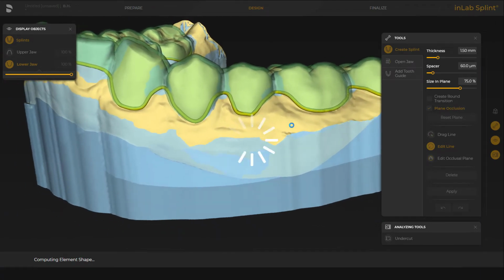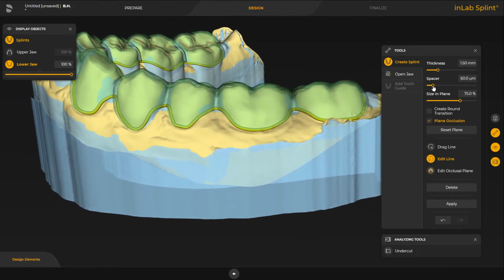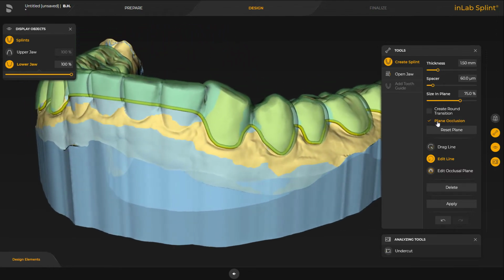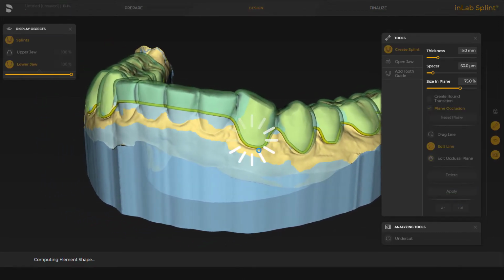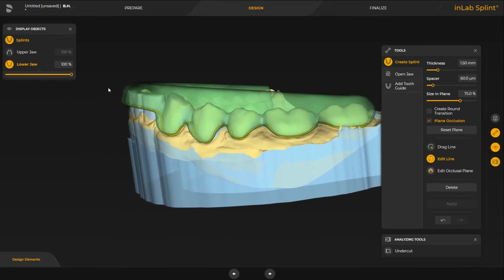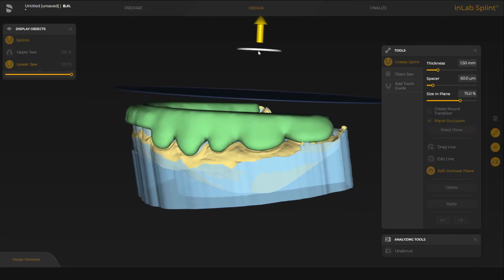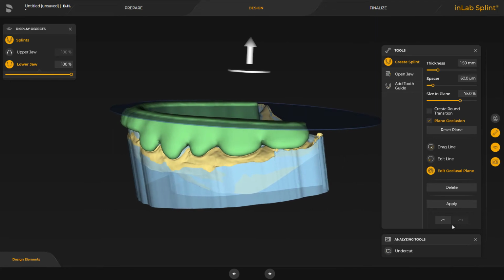The next step would be now setting the parameters. In this case, the thickness, minimum thickness, the spacer we want to have, and the size of the plane occlusal surface in case we want to have a plane occlusion. And now we click on apply and our splint will be created. In case the occlusal surface is not where you want to have it, you could do so by changing the line or even the orientation. And then the software will change the orientation here.